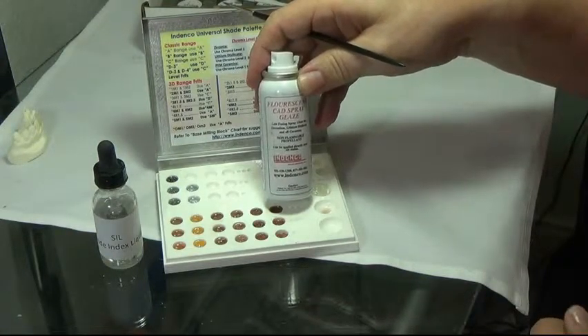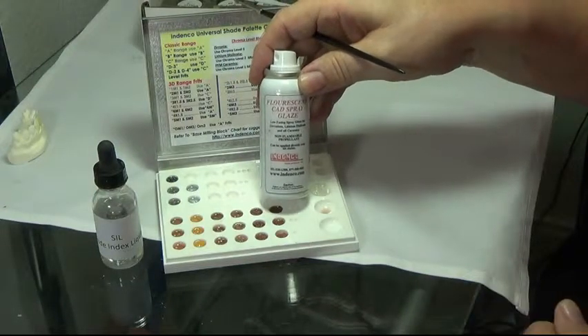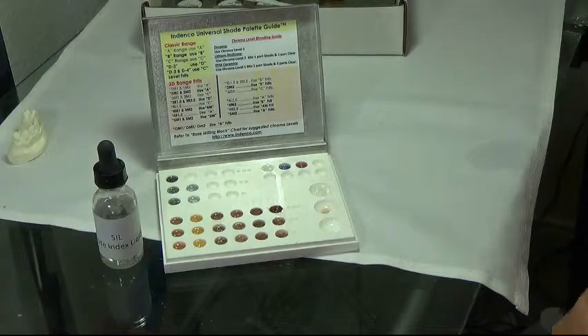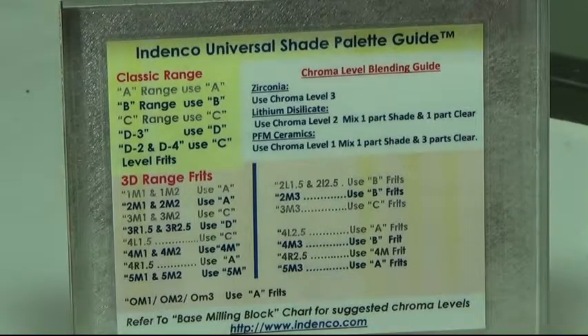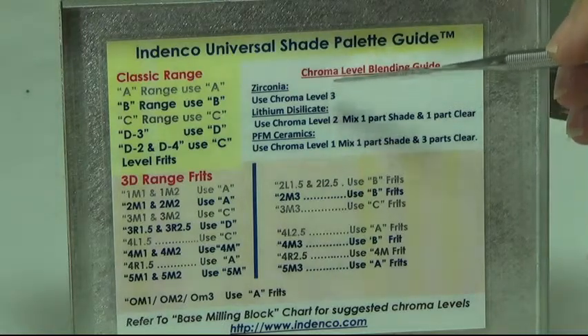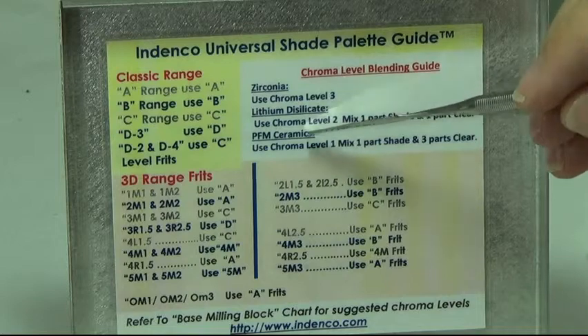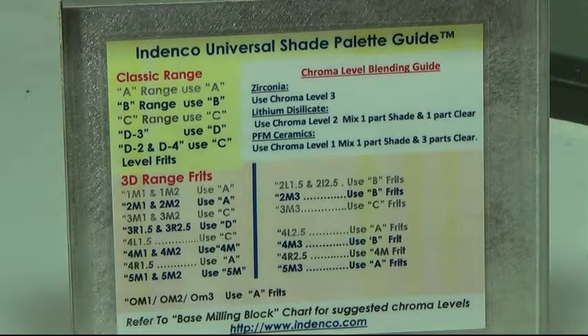In addition to your shade guideline and palette guide, the chart here enables you to have a guideline for lithium disilicate, PFMs, and zirconia ceramics — showing what shade level works best for each individual type of porcelain.